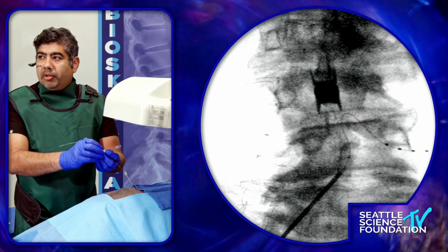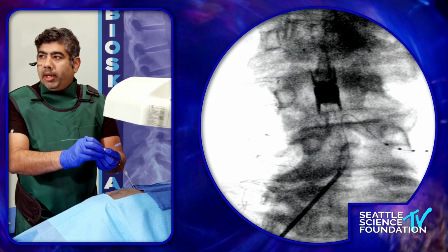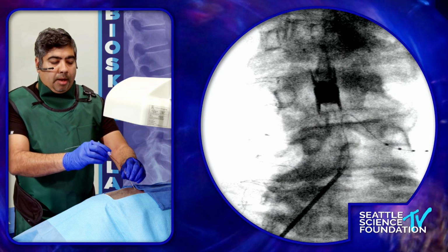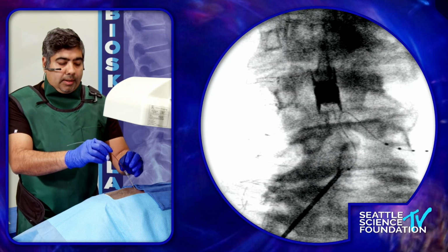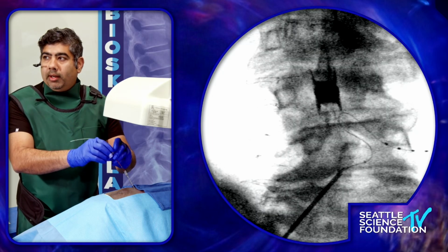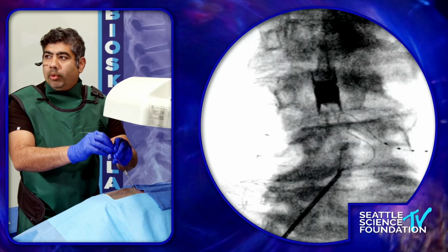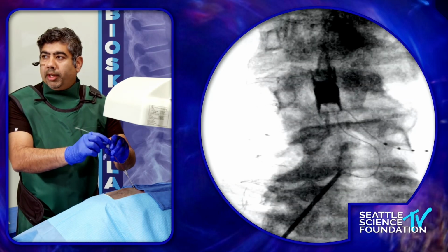Now remember, the job of the driver is done, so I'm going to get the driver back in the parking spot. My top loop is undisturbed. My contacts, I'm happy with them. Now I'm going to move everything to somewhere around 4 o'clock or so. You can see that. So I'm going to use the driver or the sheath to aid in formation of the bottom loop, and I'm going to hold it there. Now, the job of the driver is done, so the driver needs to come to the parking spot. So I'm holding the lead while I'm pulling back the driver. The driver comes back to the parking spot.